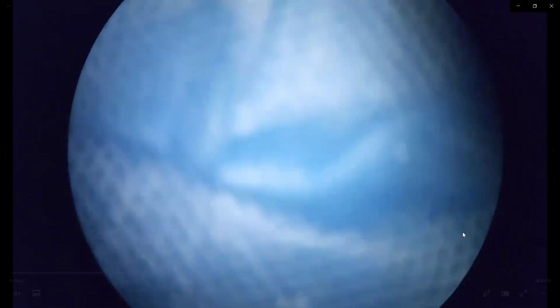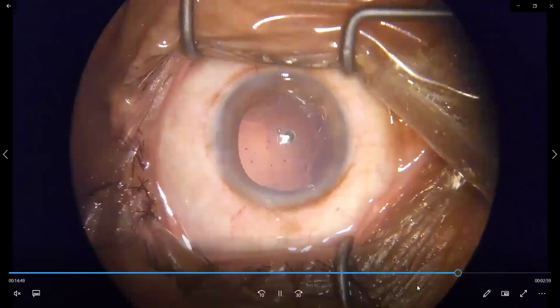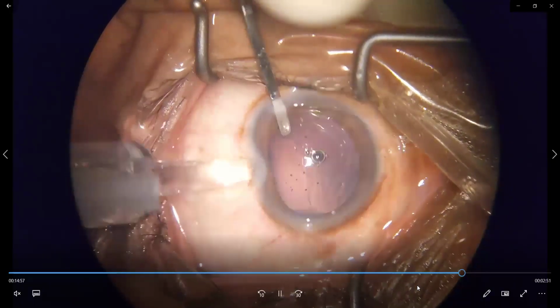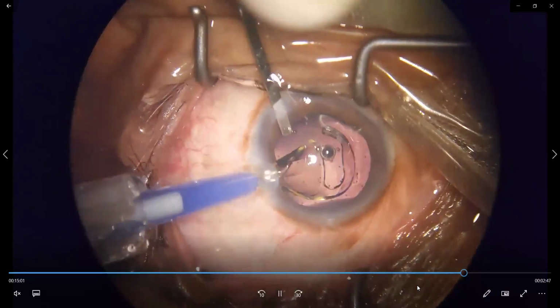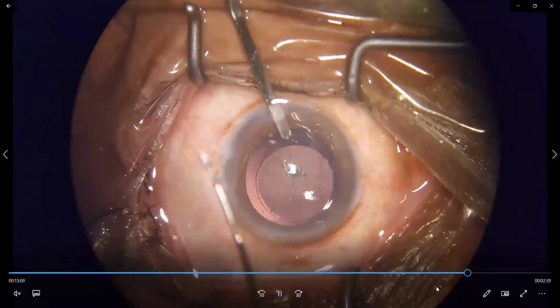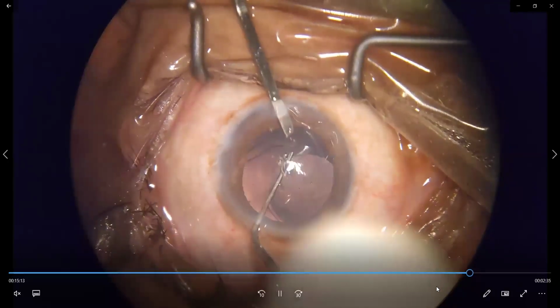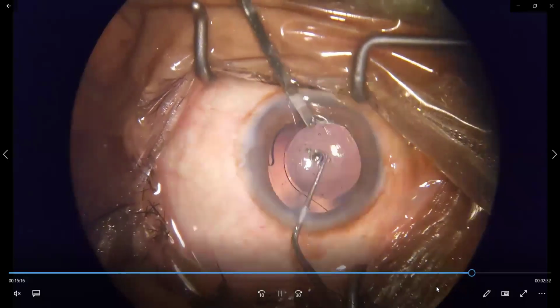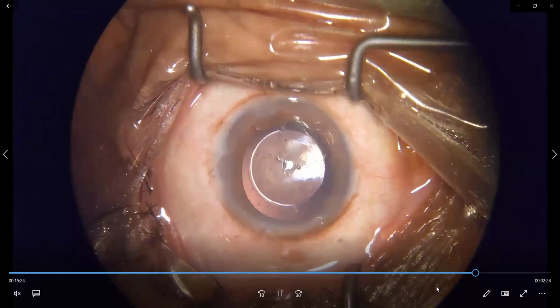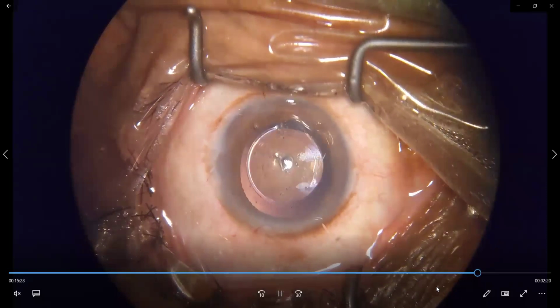The placement of the optic and the haptic has to be proper within the groove so that it doesn't get caught in the cartridge and break it. So the cartridge is then loaded into the injector, and this is a wound assisted implantation. What's the wound size? The wound is 2.4. Yes, and because these are not designed for 2.4, these are designed for 2.8, just the tip goes inside within the tunnel, and it is pushed inside.